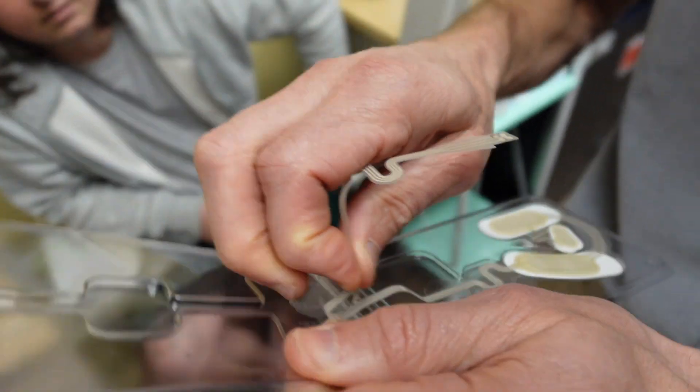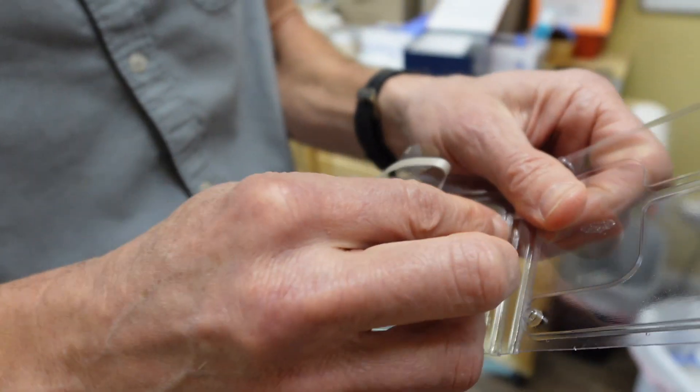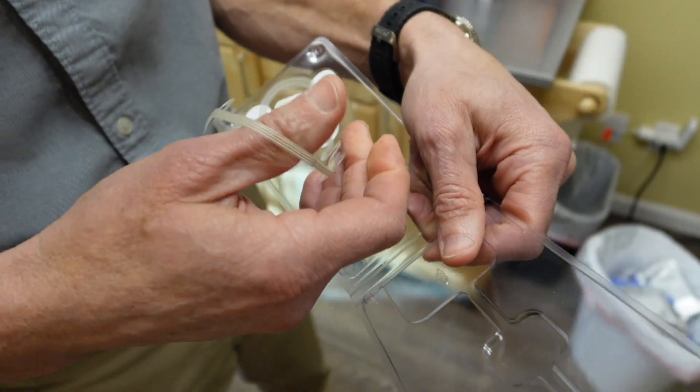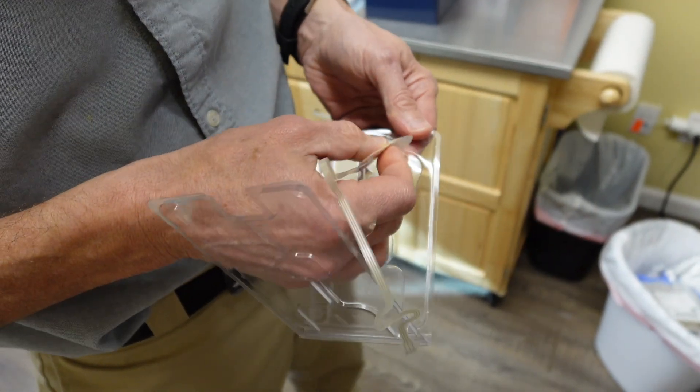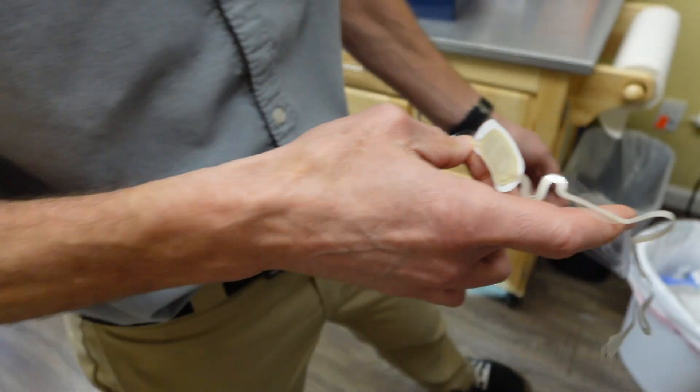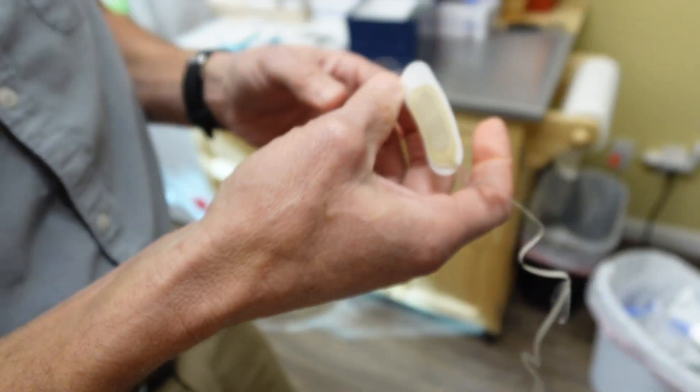It's really just a thin, tiny wire. You might even just accidentally tear it getting it out if you're not careful. The little sticky part goes inside the inner ear, just the auditory canal. There's another electrode that goes in front of the ear — pre-auricular — and one that goes behind the ear, which is post-auricular.